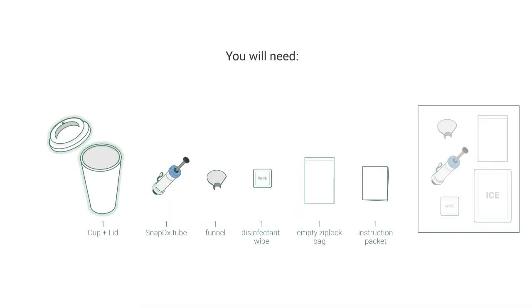When you are ready to begin, find a good, clean, flat surface, then open the cup lid to remove the kit components. You will need one of each of these items to conduct this test. Keep the remaining items in the refrigerator and not a freezer.